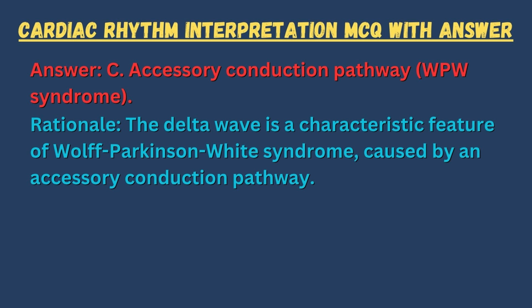Answer. C. Accessory conduction pathway, WPW syndrome. Rationale. The delta wave is a characteristic feature of Wolff-Parkinson-White syndrome, caused by an accessory conduction pathway.